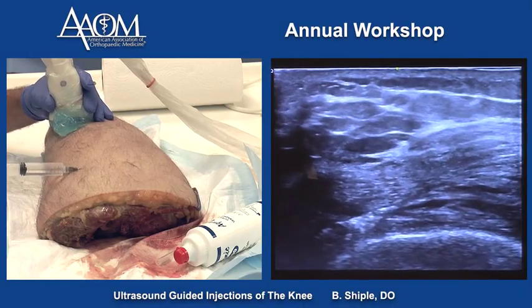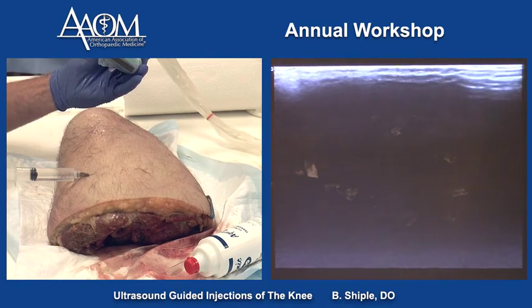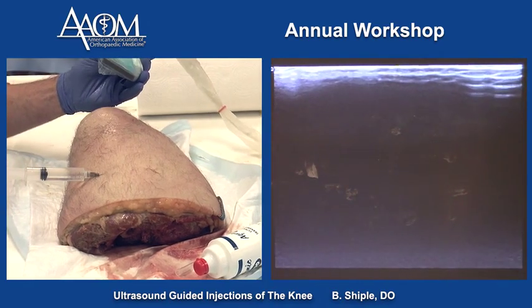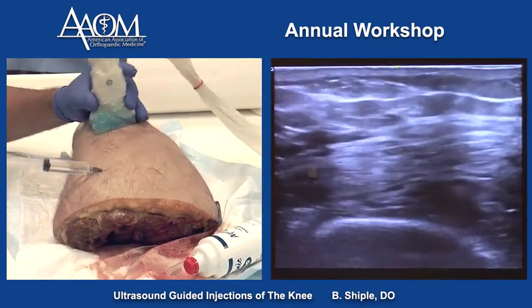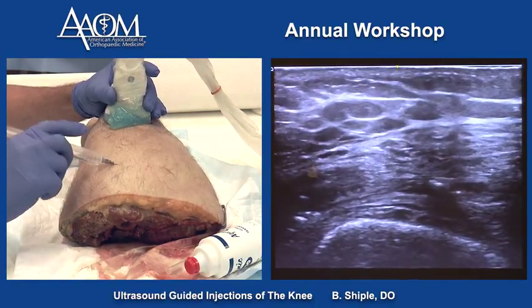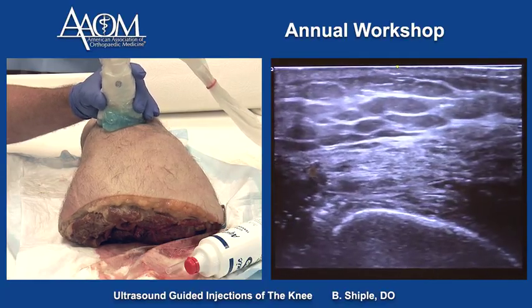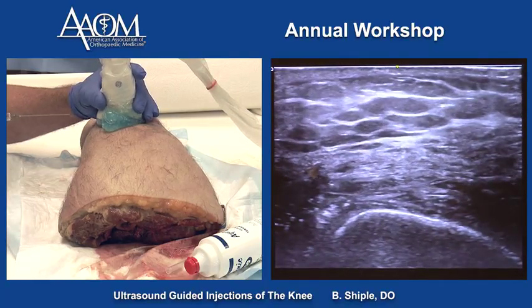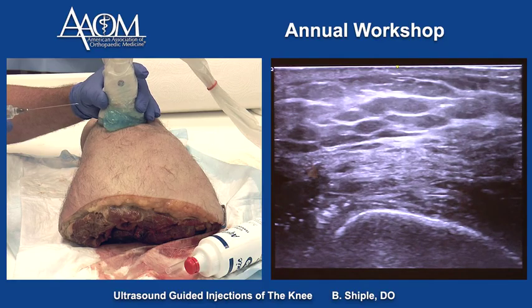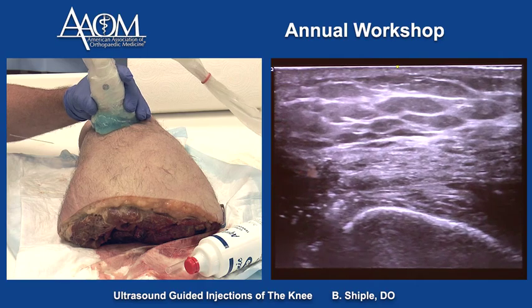We're going to inject the knee joint using the standard suprapatellar pouch lateral approach. The probe goes short axis over the quadriceps tendon, and we're going to take our needle bevel up and aim for the potential space between the quadriceps tendon and the fat pad, which lies right over the top of the femur.